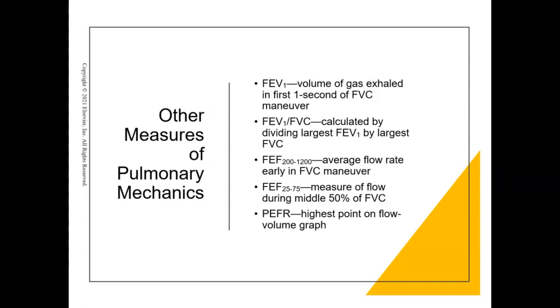Last thing to say about FVCs before we move on to MVVs: patients need to exhale until they reach that expiratory plateau. That usually needs to be at least 6 seconds, okay? The expiratory flow plateau I'm looking for is where I see no more air coming out of the lungs, so it's going to kind of flatline. And when we're in the lab, I'll show you this.